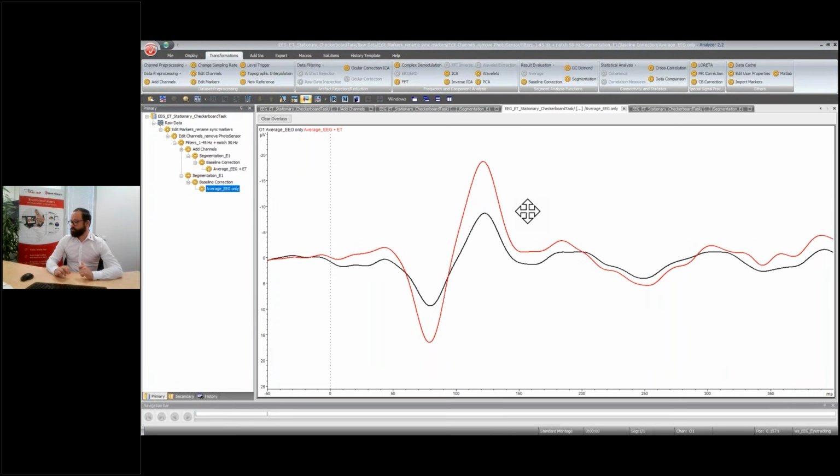And that's already what I wanted to show you. So I hope it was a nice example. It's very simple, as we said before, but I think it can make a nice point why the eye tracking data is actually very useful. Okay, then let's go back to the slides shortly.